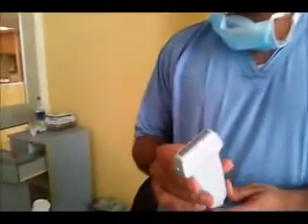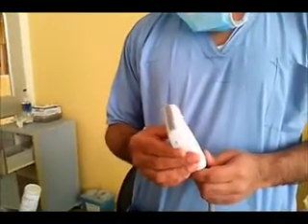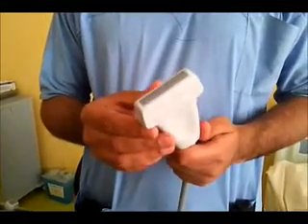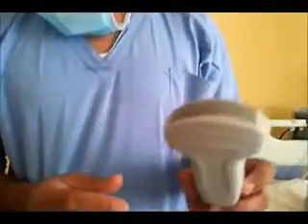I will demonstrate the basics of lung ultrasound. For lung ultrasound, we have a small portable bedside ultrasound machine. We will be dealing with two probes. The first and most commonly used is the thin linear probe with a frequency of 5–10 MHz, useful for assessing relatively superficial structures like the pleura and underlying peripheral lung tissue. For patients with a thick chest wall or to assess deeper lung layers, we use the curvilinear probe with a frequency of 3–5 MHz.